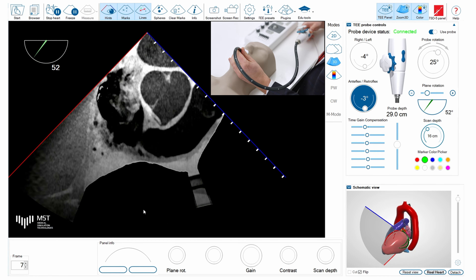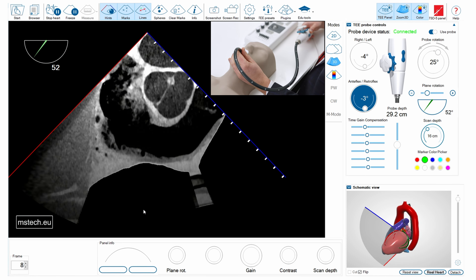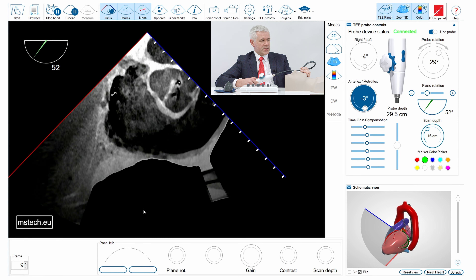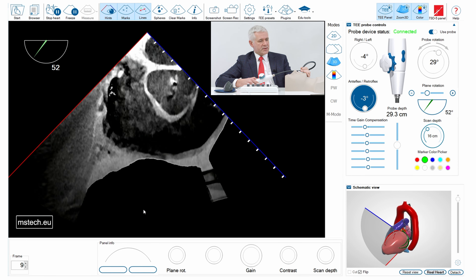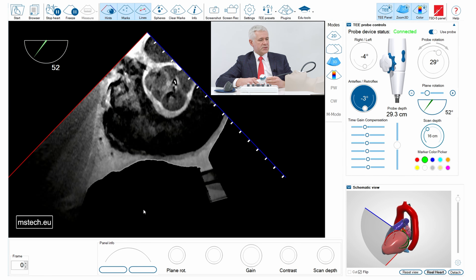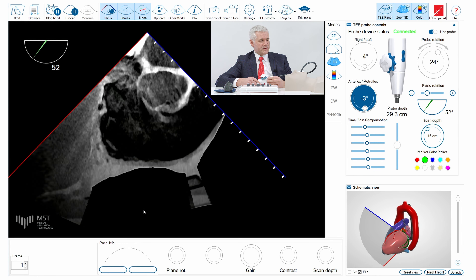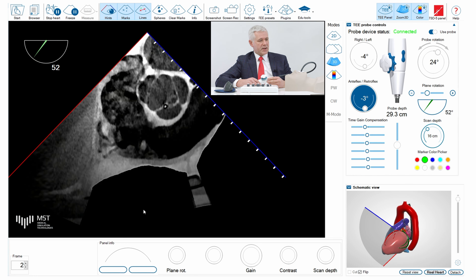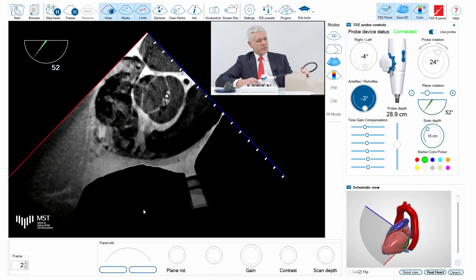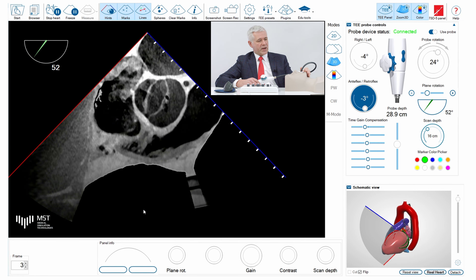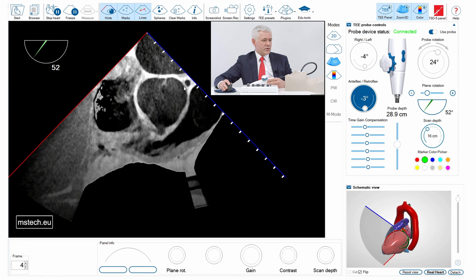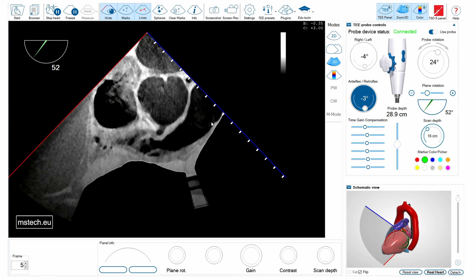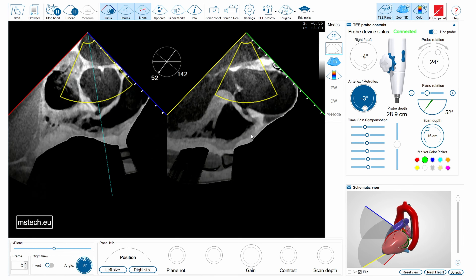The pathology visible here is very unique. You can see that there's probably a bicuspid aortic valve with calcification of the fused cusps. The fusion is between the left and right coronary cusps — I can recognize it by the location of the coronary arteries, which are here and there. Let's have a look at the 3D image of this valve.